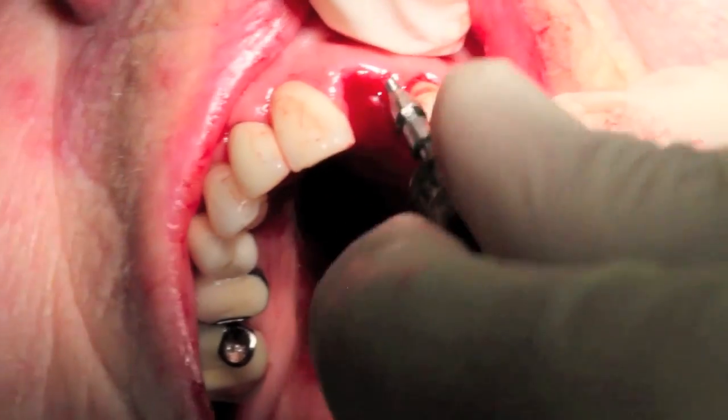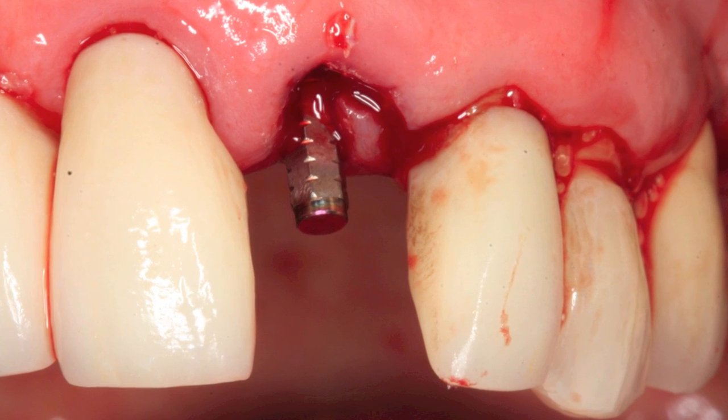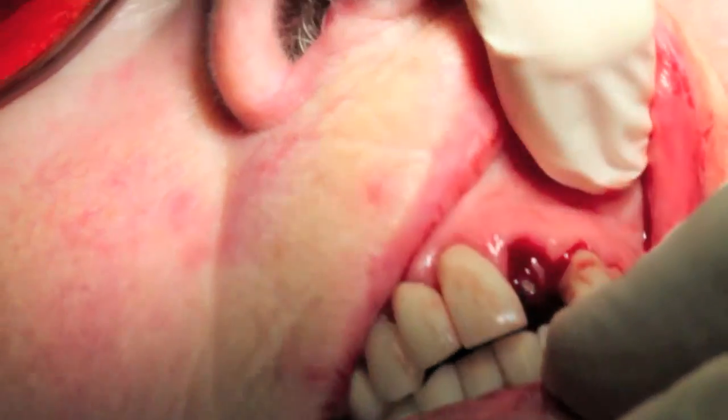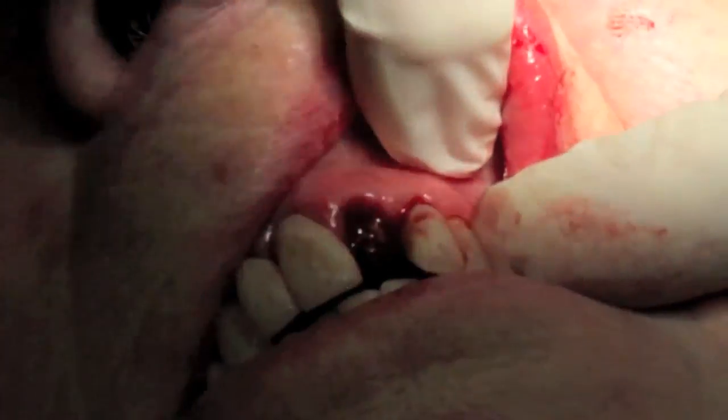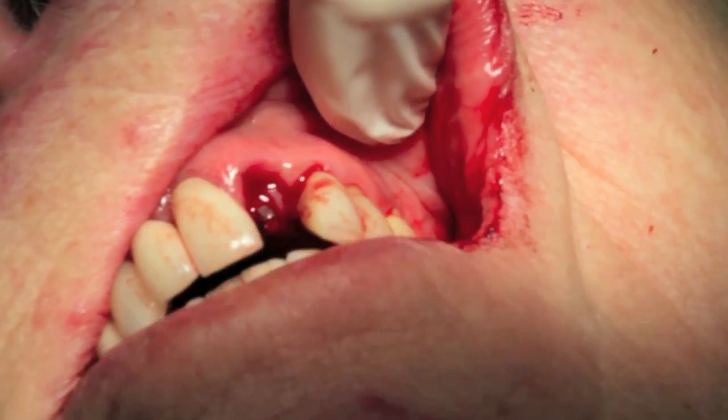So here we're taking the immediate temporary abutment. This is going to be placed on, and we're going to tighten this abutment down to 35 newtons, or you can go somewhat under that as well. But ideally, you want to be able to have that abutment stable, and then we're going to come back and create the beautiful temporary crown once we know that this is in position.